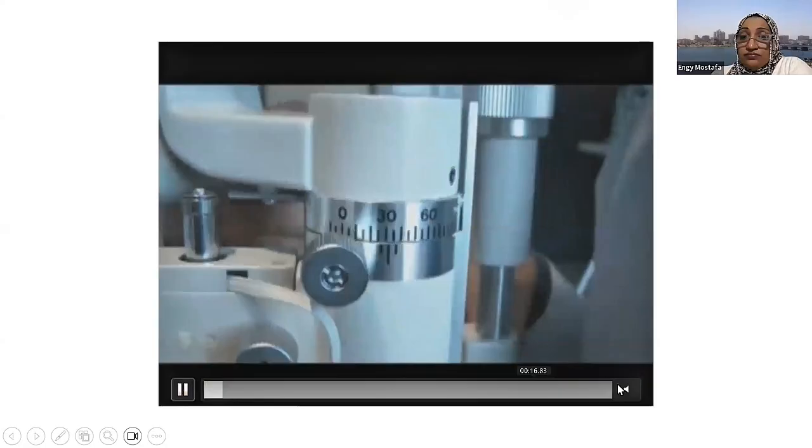Then we're going to narrow the beam up to like 1 to 2 millimeters in thickness, and we're going to take optical sections into the cornea itself. We are looking for what? We are looking for opacities, scars, vessels, and of course, this also gives us an idea about the depth of structures found in it. Like here, there's a corneal foreign body, different forms of cataract, patchy iris and corneal opacities like in here. So by the direct illumination, we can also detect KPs on the back of the cornea.